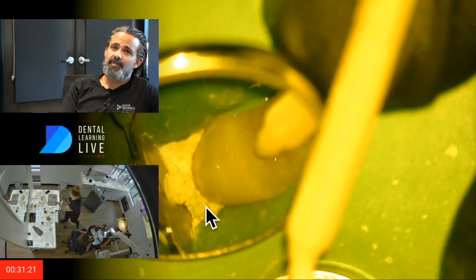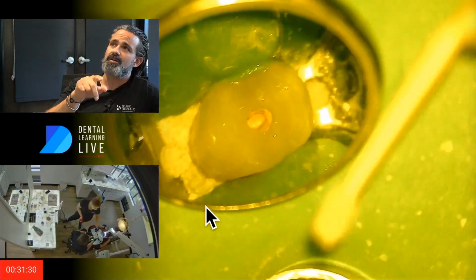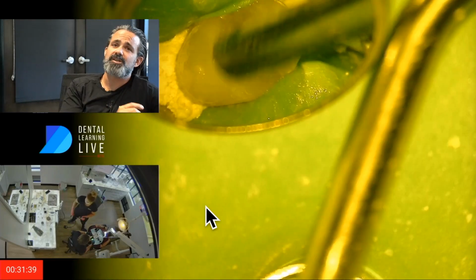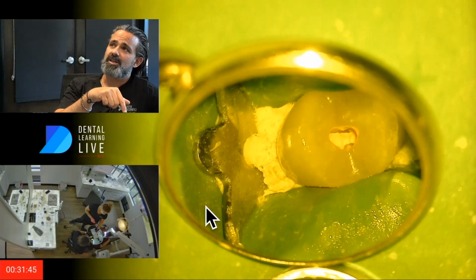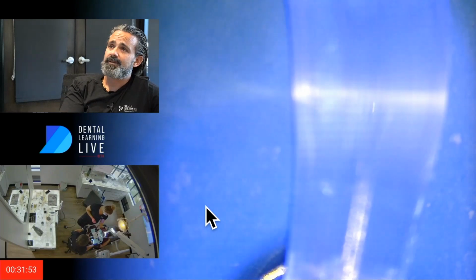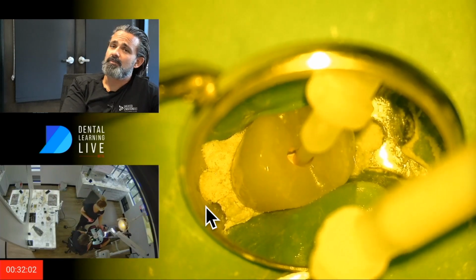And if you look, I am actually putting it over the occlusal table, frankly, because if there's any activity or affected dentin in that connection between composite and tooth, I at least want my bonding agent to fill it up. And I'm talking on a very small level because obviously it withstood the GentleWave. But if the GentleWave microscopically opens something up, it makes me sleep at night if I can actually just go over those margins of the filling and just put bond over the top of it. I don't know if that matters, but it makes me feel good. It probably doesn't, but I don't know. We've got to get someone like Capasalo to look at that for us. But I think it's an important question to ask.